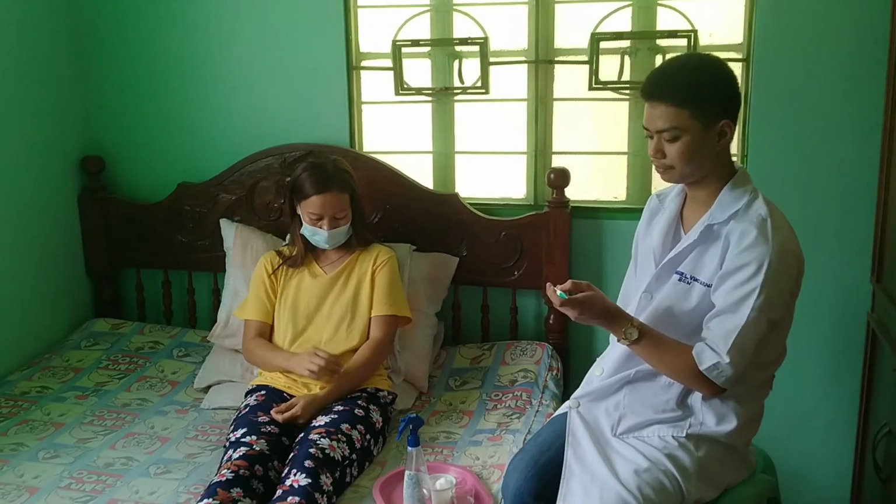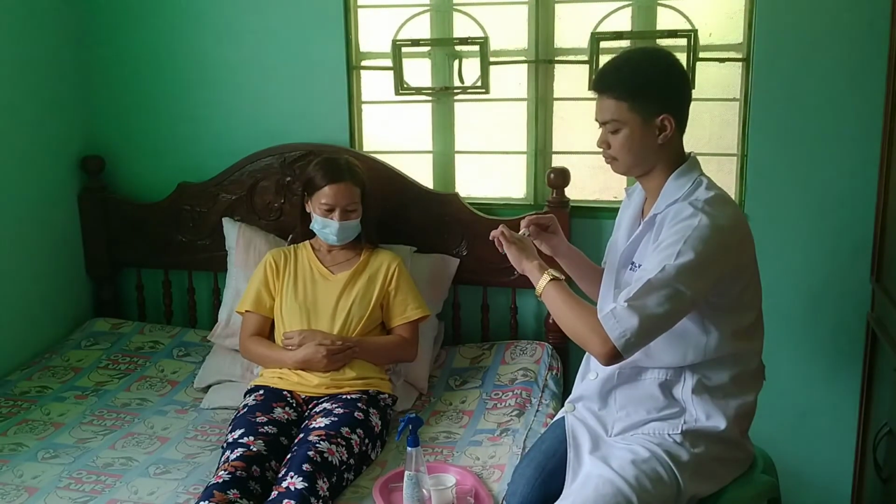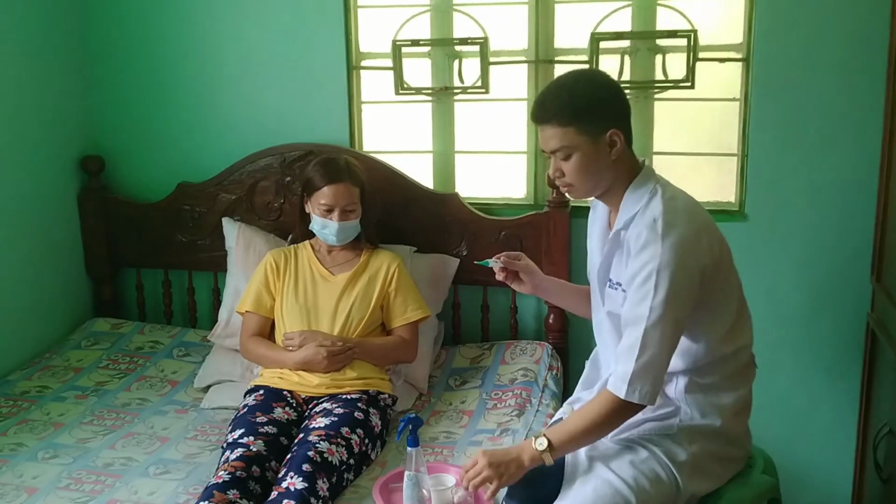Read the temperature of the client. After using it, now clean the thermometer from body to tip. And dispose of the cotton ball.